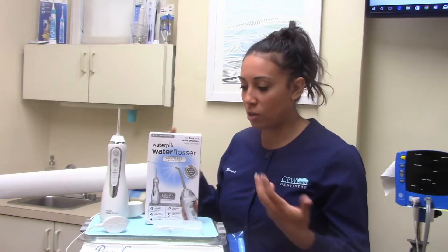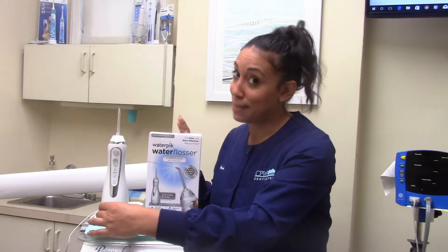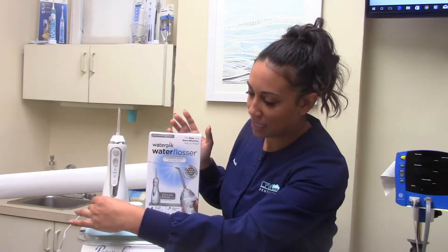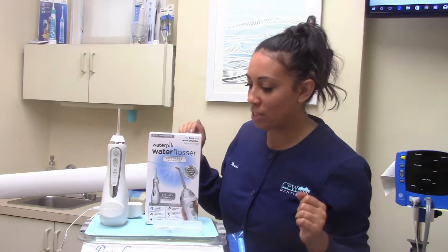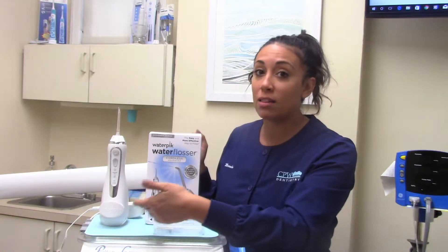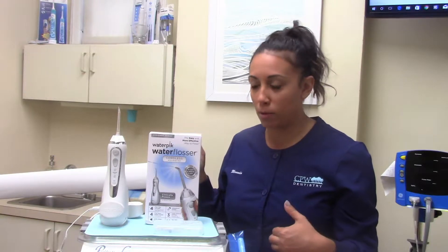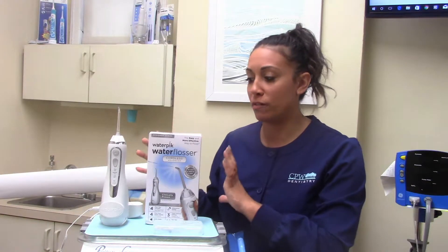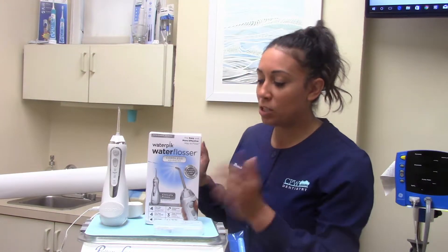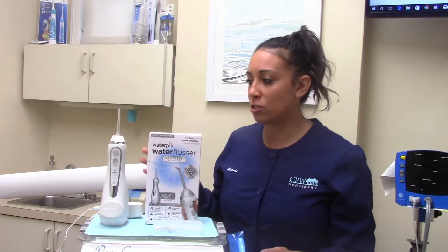First and foremost, when you take it out of the box, make sure that it's charged. The charger here on our Water Pik cordless advanced flosser is magnetically connected — you just pop it on, like magic. When you plug it in, the light should turn on showing you that it's charging. If the light doesn't turn on, most likely it's not charging, so double check for any manufacturer problems. Make sure it's charged about four to six hours before use. It comes with a little bit of charge, but make sure it's all charged up so it doesn't die on you.